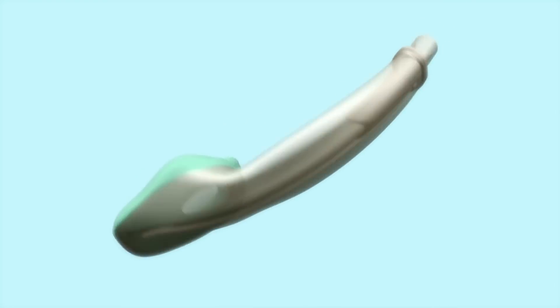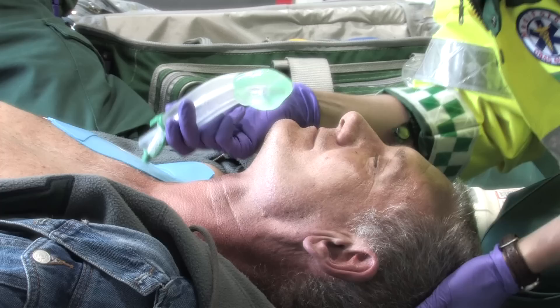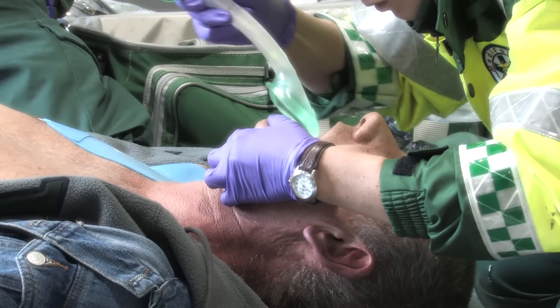Our standard IGEL device already has an established reputation in resuscitation, and that's really based on how easy and rapid it is to insert, also on the fact it has very high seal pressures and the improved safety offered by the gastric channel. The new ERC and AHA guidelines have highlighted the importance of high quality chest compressions as the key component of effective CPR. As a result, this only increases the importance of easily, rapidly and reliably establishing a patent airway.